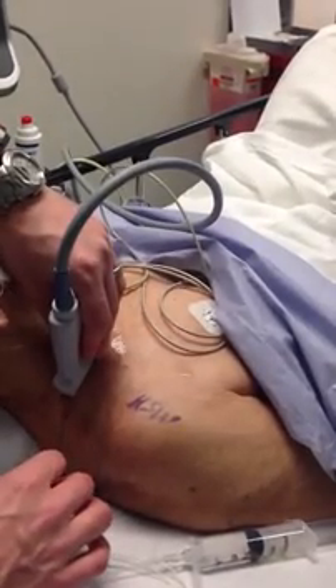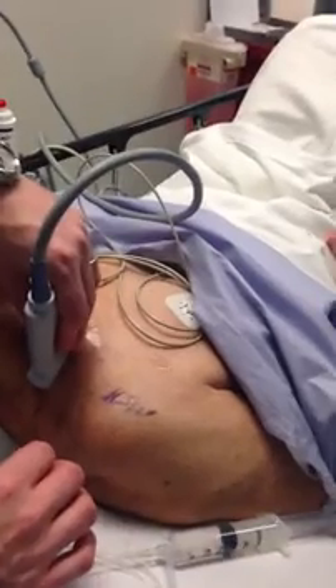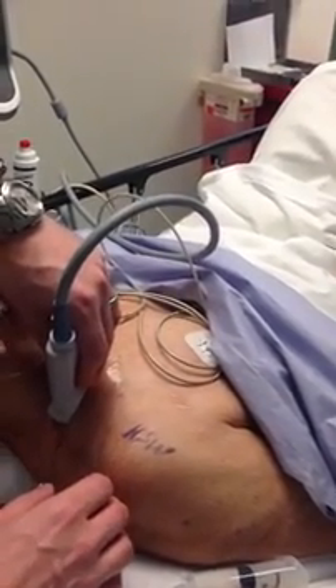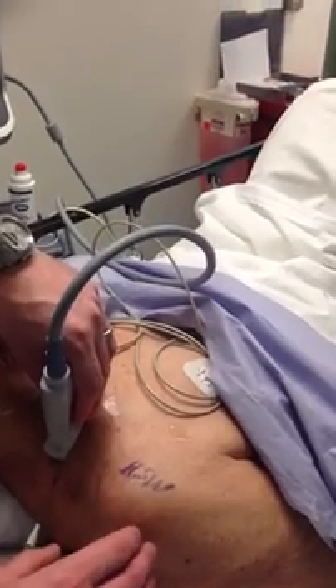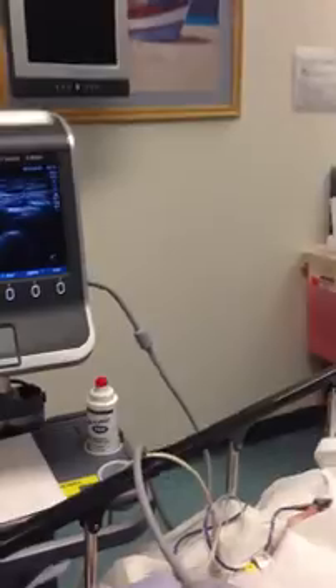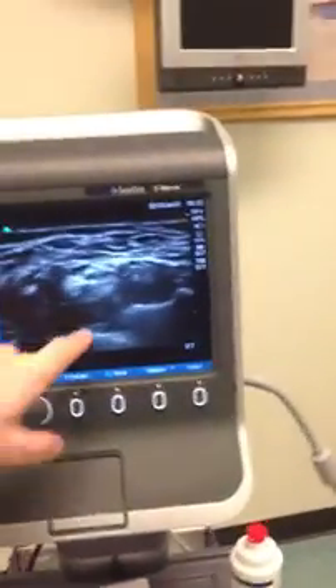I'm doing a supraclavicular brachial plexus block, but particularly going towards the axillary component so I don't get a block below the elbow. The way I do that is I find the nerve on the screen. This is my brachial plexus right here. This is the pleura.